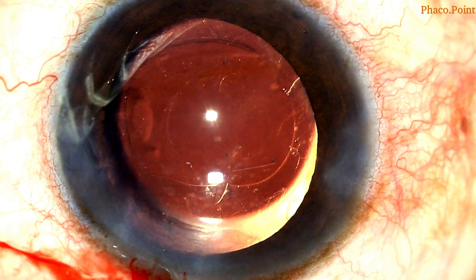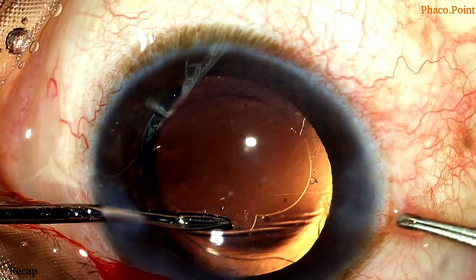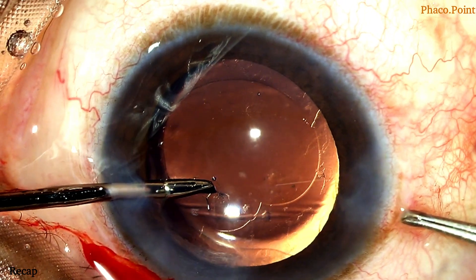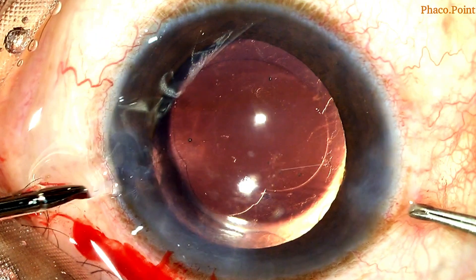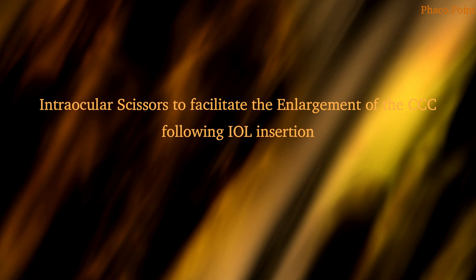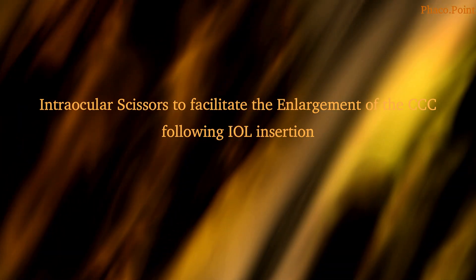The problem with the notch is that once you hold it with the forceps to extend it further, you actually have to create yet another tear and then extend it, as demonstrated here. This lacks control, increasing the chances of it going out into the periphery. So there has to be another way. A more predictable way of enlarging a RHEXIS after IOL insertion is the use of intraocular scissors to create a tear in the RHEXIS prior to extending it. Here's how it's done.